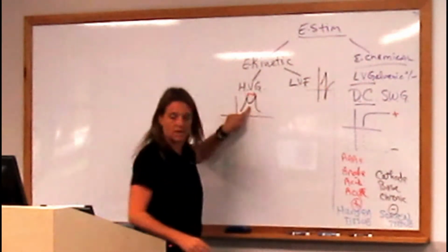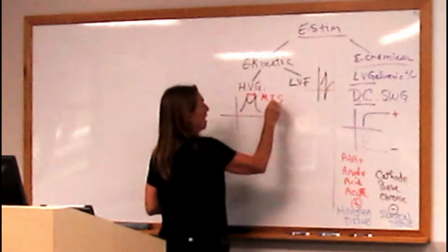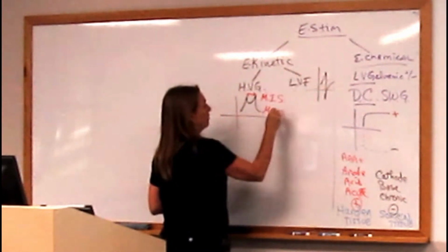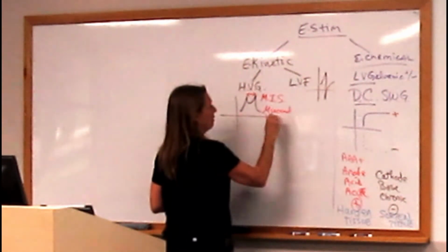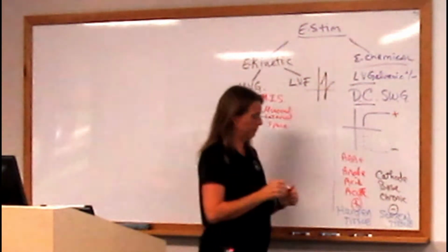So this little part right here, I'm going to label it, it's called the MIS, and that's the microsecond interval space. So it is a time thing.